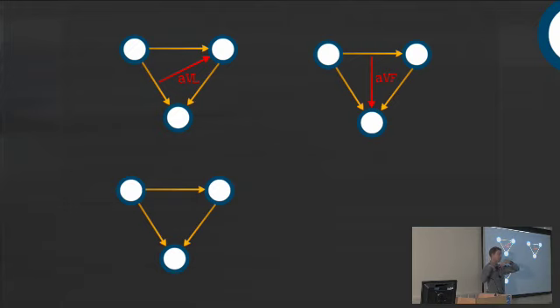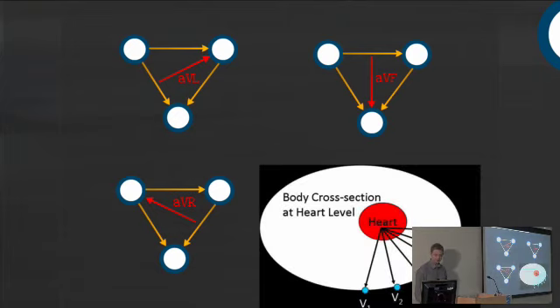You're imagining the negative electrode is right here, and you're looking at the travel of electricity down towards the green electrode, which is roughly in the middle. So it's looking straight down. We call that 90 degrees. And for aVR, you're taking the average of these two, the left shoulder and the green, and you're looking at the electricity spreading up towards the right shoulder. So that's going not just straight to the right, but even further up. So that's where that diagram comes from.